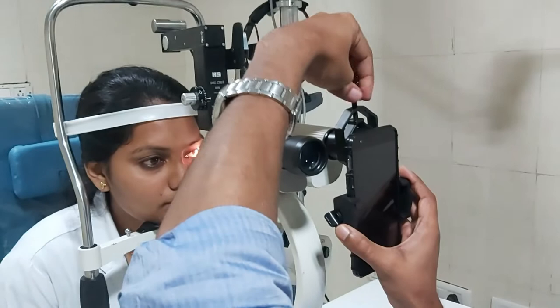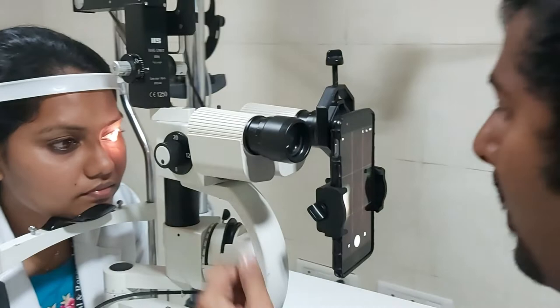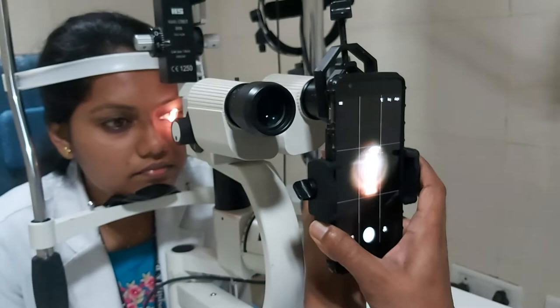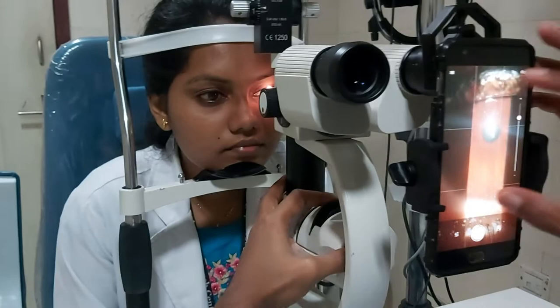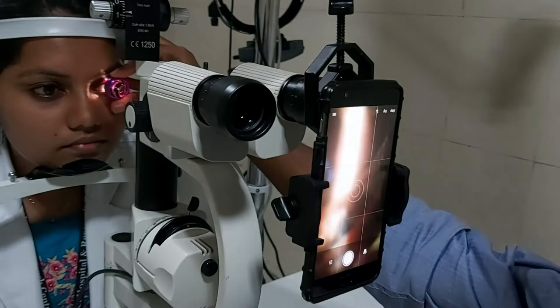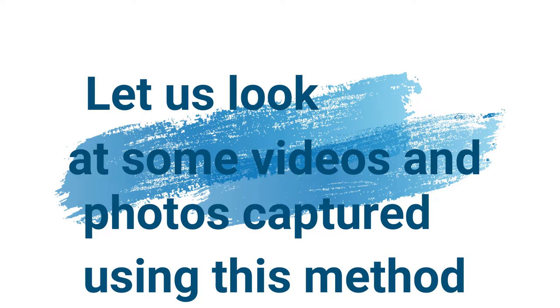Pull it backward if it allows. Turn on the camera and adjust the position of the phone so that it is centered in the circle of light. Pull back until you get the complete circle of light. You can zoom a little bit. To take a 90D video, use the lowest magnification and zoom. Let's see some of the videos and photos captured using this method.